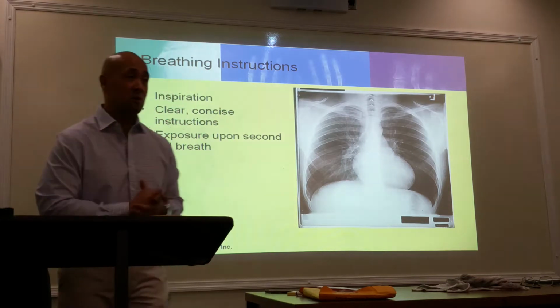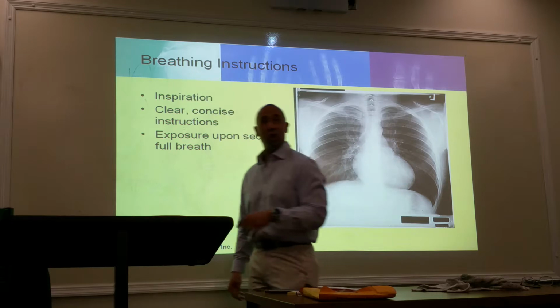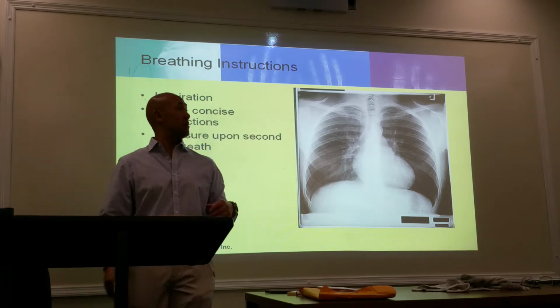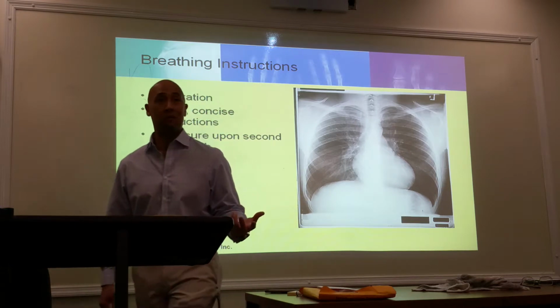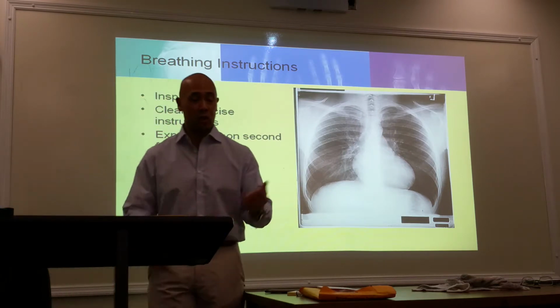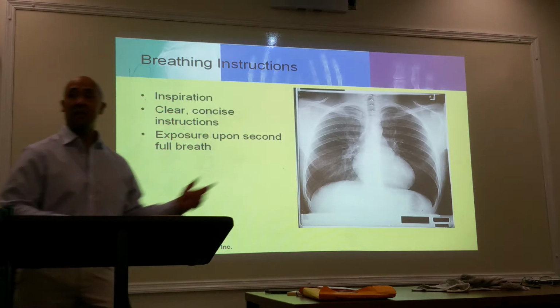Because I think I told you this before. You're telling them to take a deep breath in and hold it, and the moment that you turn around, they do this. Or they think that when you leave the room, it's okay to breathe. Okay? So you don't want them moving, you don't want them breathing. Keep your eye on them as you're making the exposure.